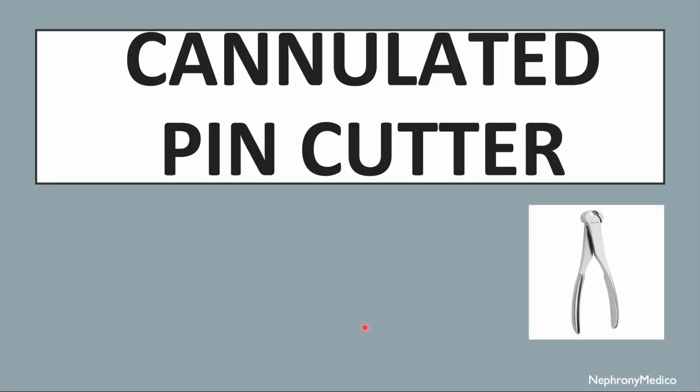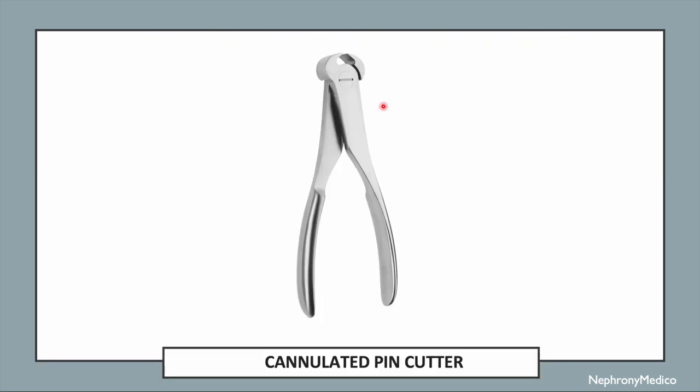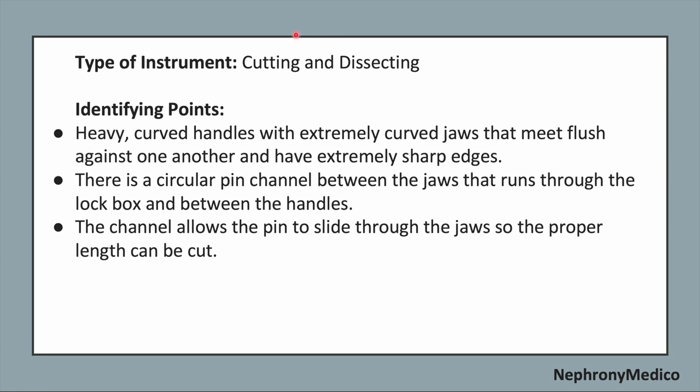Let's talk about cannulated pin cutter. This is a picture showing cannulated pin cutter. It is a cutting and dissecting type of instrument. Now, identifying points: it has heavy curved handles with extremely curved jaws that meet flush against one another and have extremely sharp edges. There is a circular pin channel between the jaws that runs through the lockbox and between the handles. The channel allows the pin to slide through the jaws so the proper length can be cut.